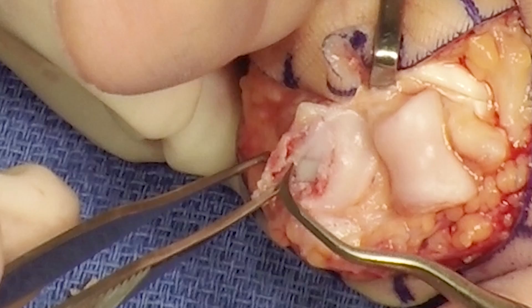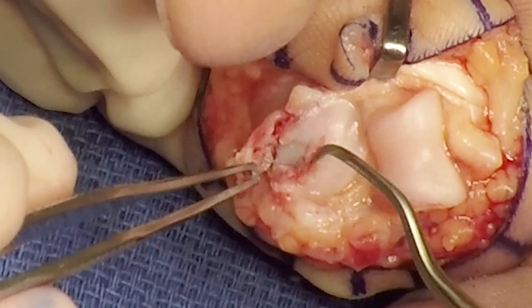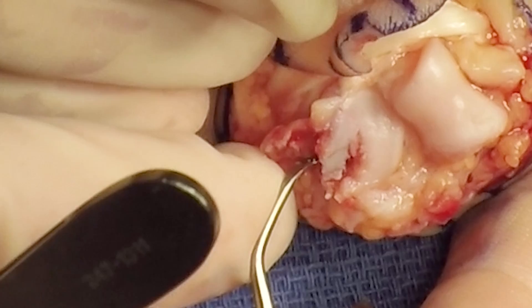The volar rim is gently elevated in order to gain access to the fracture site. The articular fragment is elevated, taking care to bring as much metaphyseal bone with the fragment as possible.